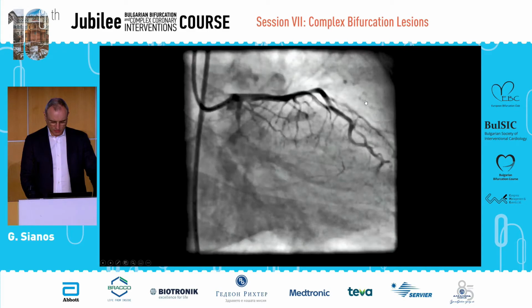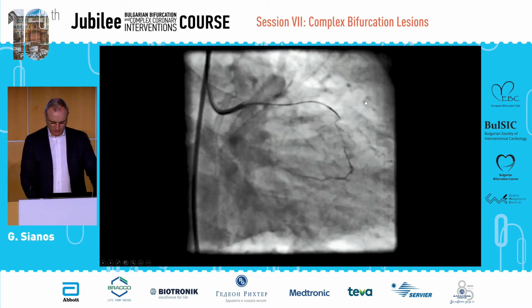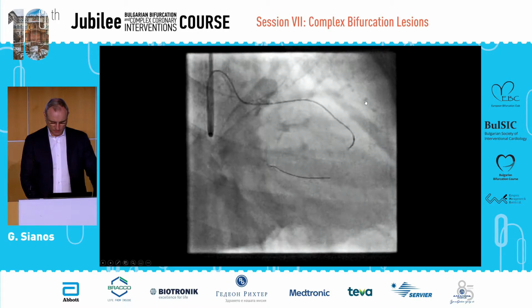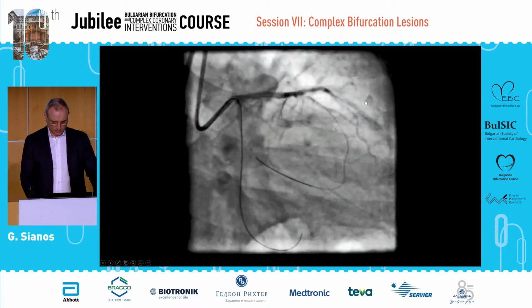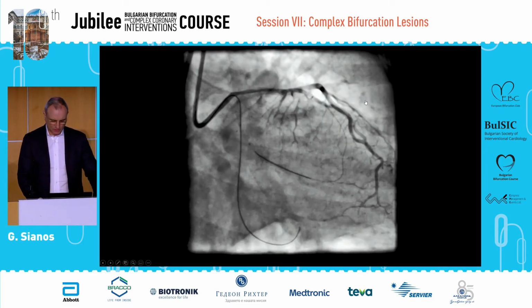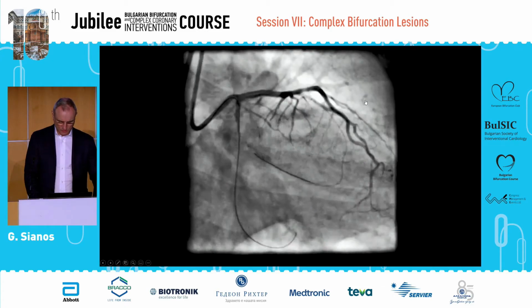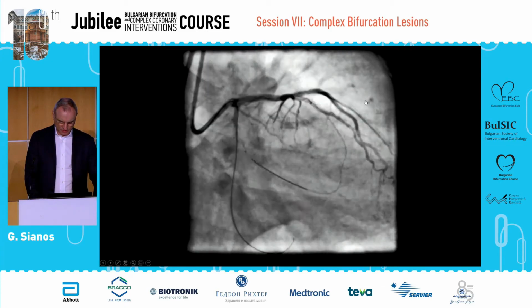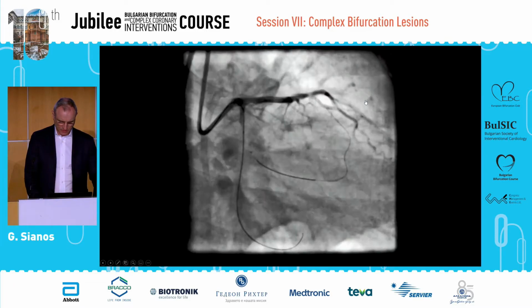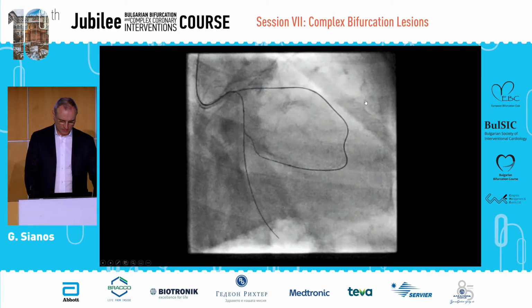You can see that the marginal is provided by an epicardial collateral, as this one. It was accessed first retrogradely. The Corsair microcatheter was not able to be advanced, but the FineCross was able to follow this collateral. Antegrade access was achieved into the circumflex in a third branch existing over there, as you can appreciate here. And the second big branch was not addressed as yet.